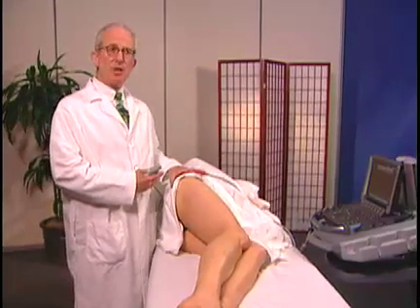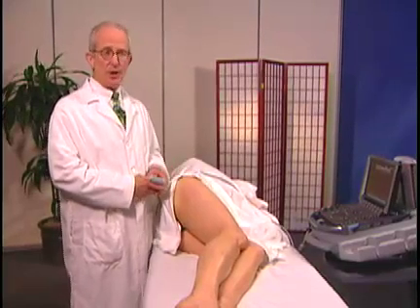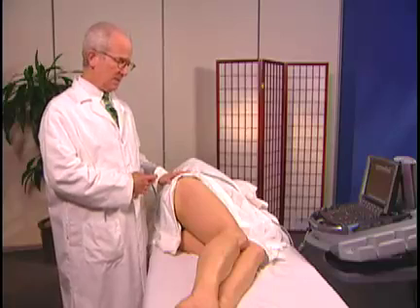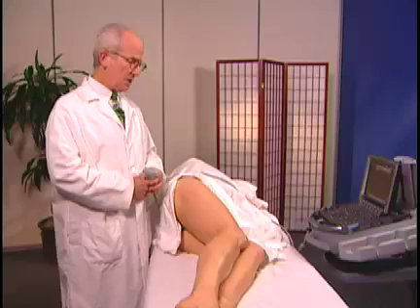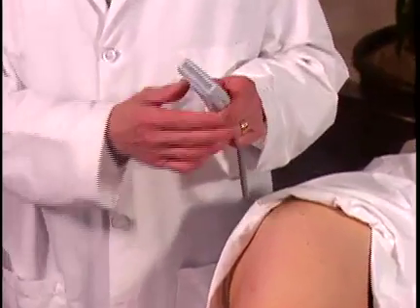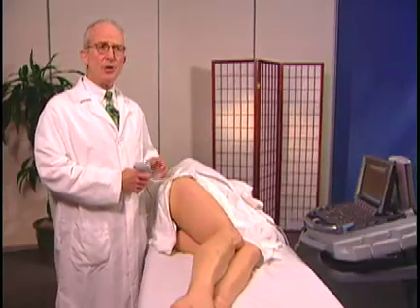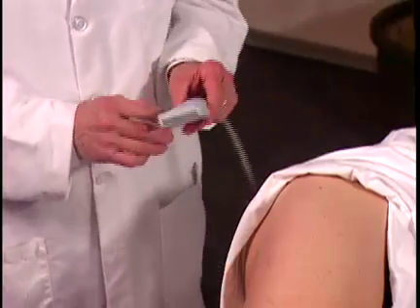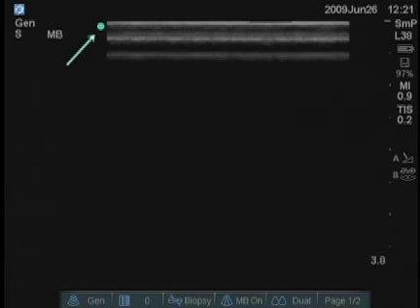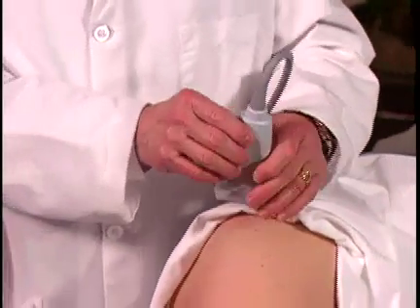I'm going to examine the lateral aspect of her hip, the greater trochanter especially. This would be an area that you can examine with ultrasound in a symptomatic patient. She's lying on her left side with her hip extended, just slight flexion position. I'm using a linear transducer now — sometimes in a person who has a much deeper area to traverse, we might use a C60. This transducer has a linear mark which corresponds to the turquoise dot on the screen, and we keep that proximal or medial.